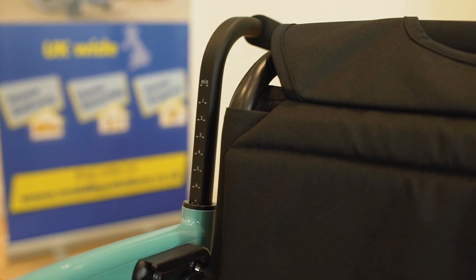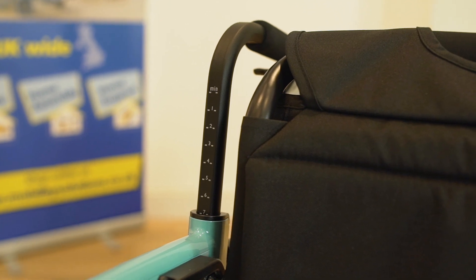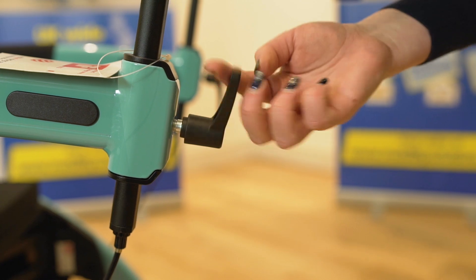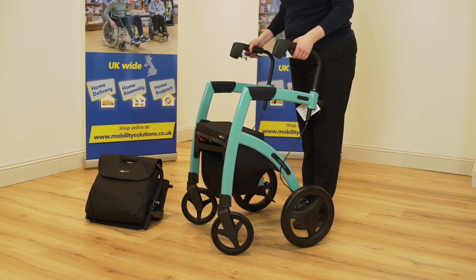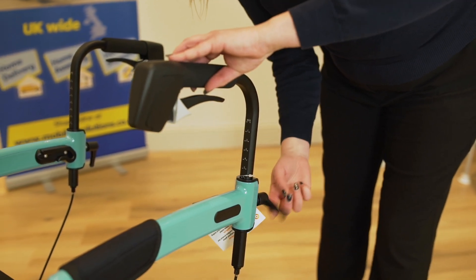The Rolls Motion 2 has fully height adjustable handles ranging from 87 to 102 centimeters for the medium size rollator and 82 to 95 centimeters for the small frame. This allows the user to find the perfect height for their comfort. The handles can also be rotated to allow for a choice of grips.